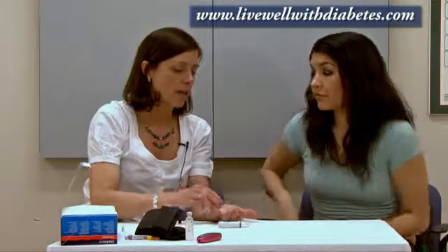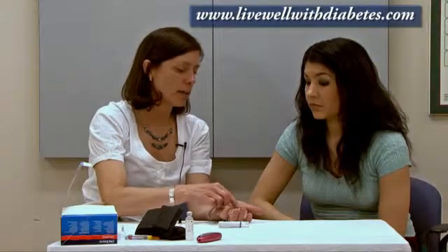About 5% of people who run blood sugar checks don't like to use their fingertips to get a blood sample. They say their fingertips get sore, or they might be a pianist or guitarist who just don't want to use their fingertips. Instead, other people use what's called alternate site testing. That means rather than using their fingertips, a person might choose to get a sample of blood from the base of the thumb, the side of the hand, the upper arm, or even the thigh area. Alternate site testing is used for some people, though it often takes a lot of practice to get enough blood from that alternate site.